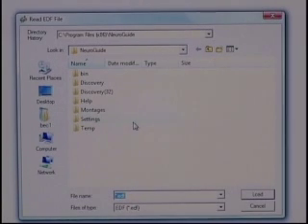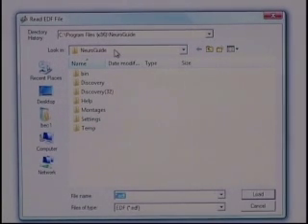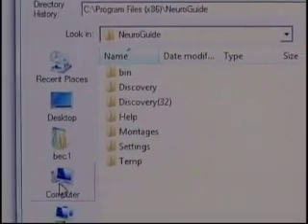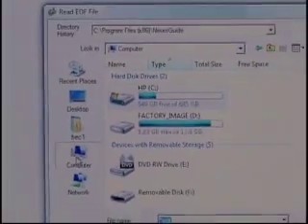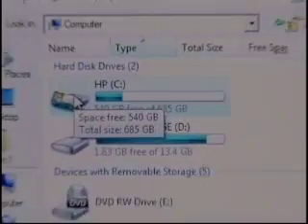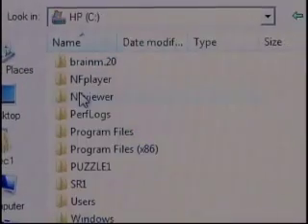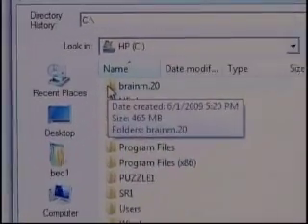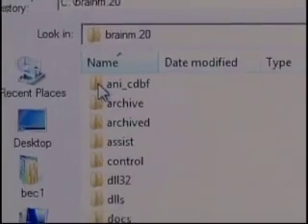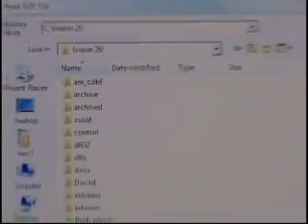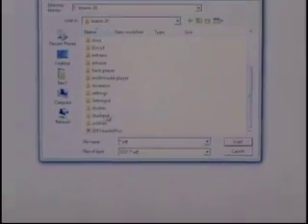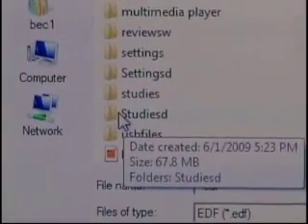It starts out looking in a place called NeuroGuide, but that's not where I need to be. Where I need to be is Computer, Local Disc C, BrainM.20, StudiesD. There it is — that means StudiesDiscovery.